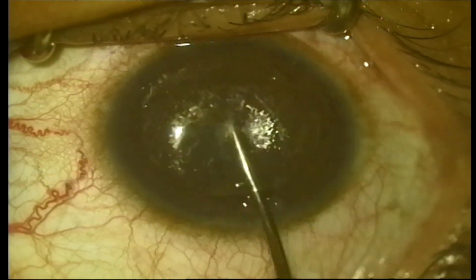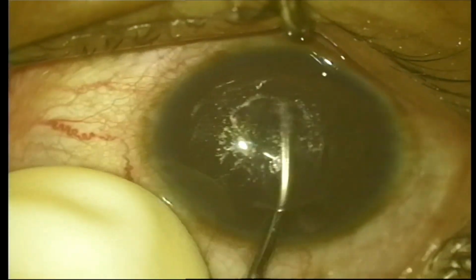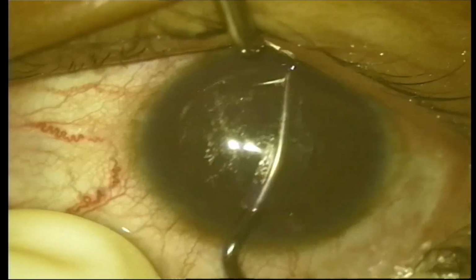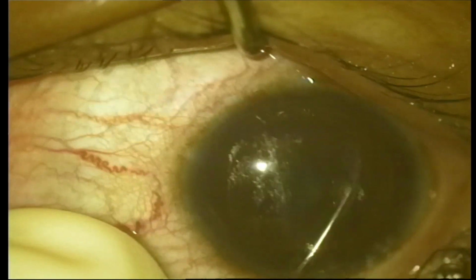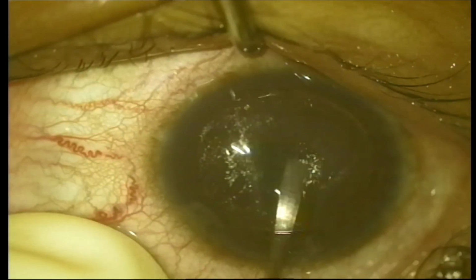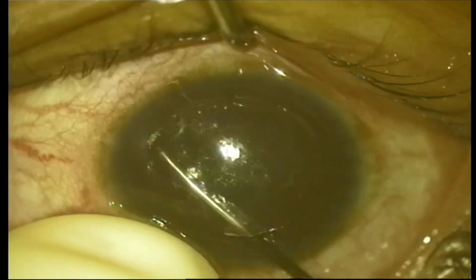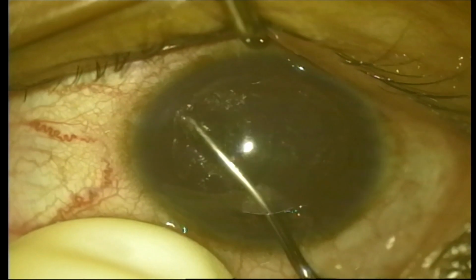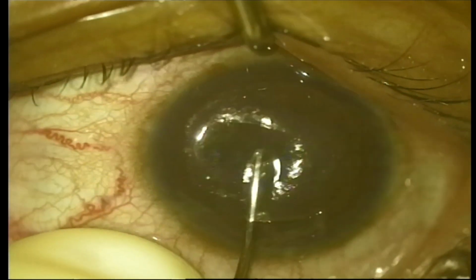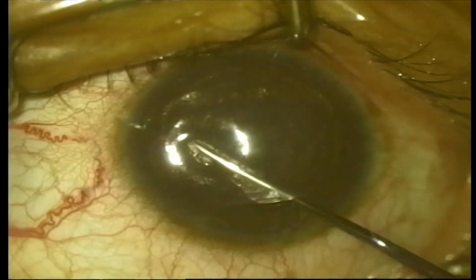As you go in, now what I will do is I will just go down at the inferior part, go outside the lenticule edge, doesn't matter, and then I will slowly, gently dissect. So you can see I am going like this, but I am not disengaging right to the top. Now similarly, I will go here and disengage from the bottom, come towards the top here, and now I have to disengage. So this is being disengaged, and from the other side also I will now disengage.